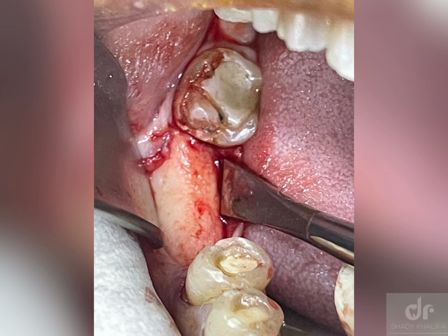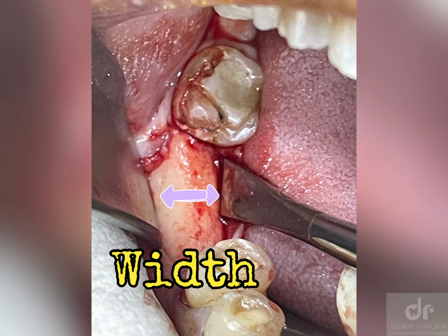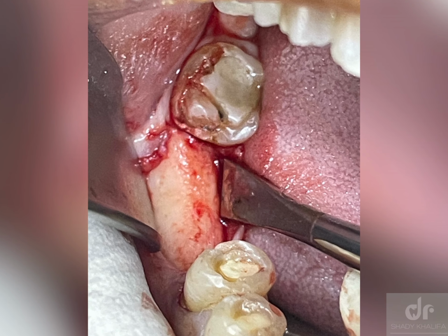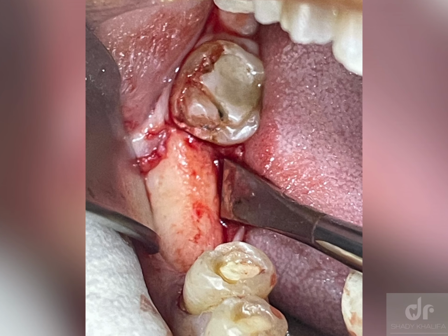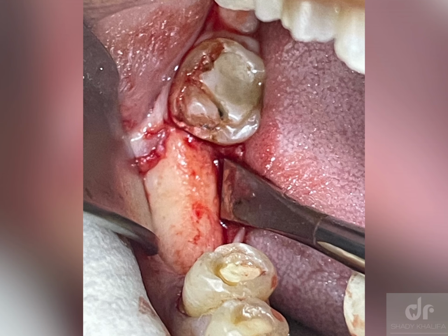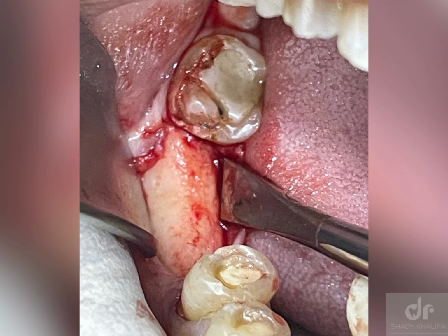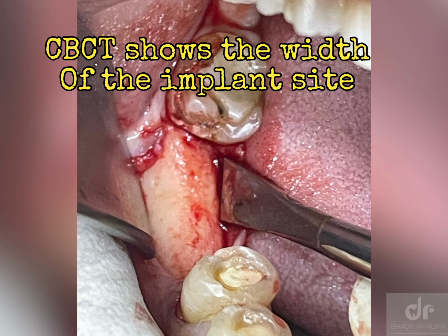Here is the photograph. In this picture we can see the width, the buccolingual width that we couldn't see on the X-ray. Maximum exposure should be done to make it easy to see the bone and its dimensions, especially if you don't take a CBCT, you have to see well with your eyes.